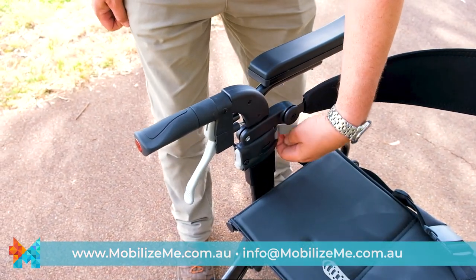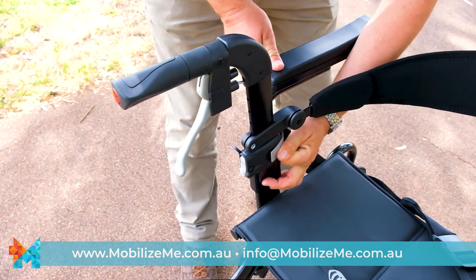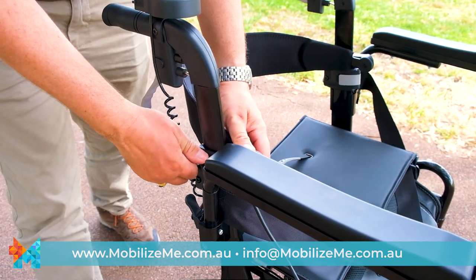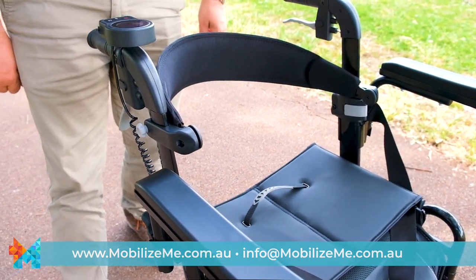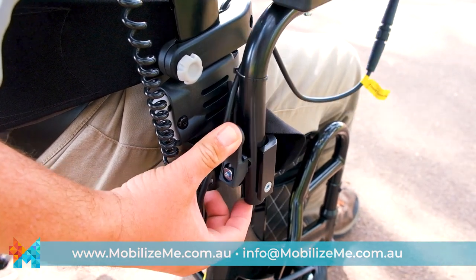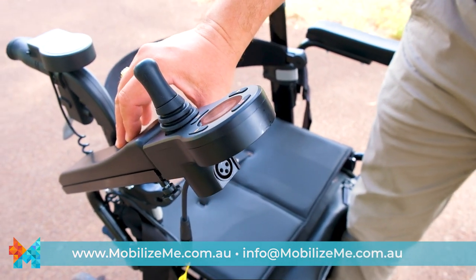Features include height-adjustable handles, a height-adjustable backrest, and flip-up armrests with an easily accessible charging port.